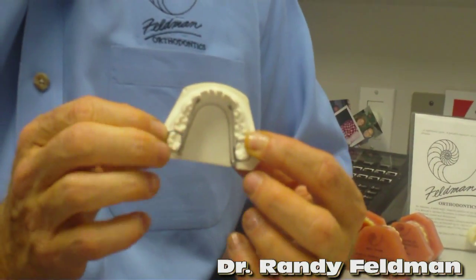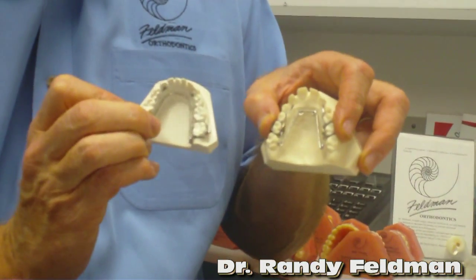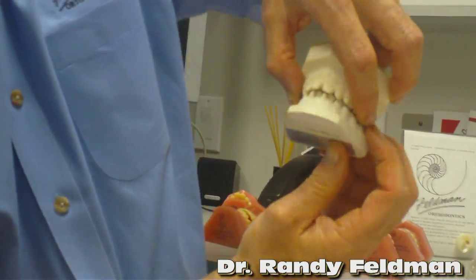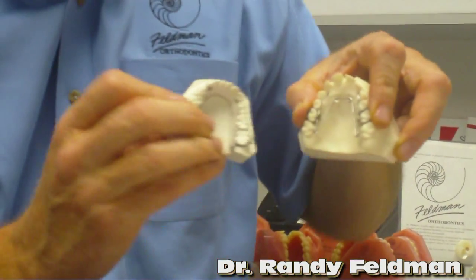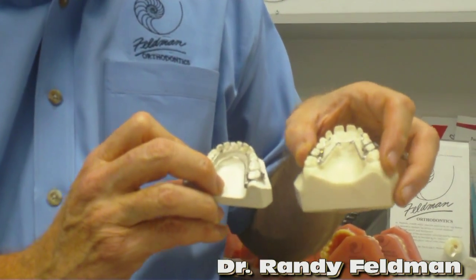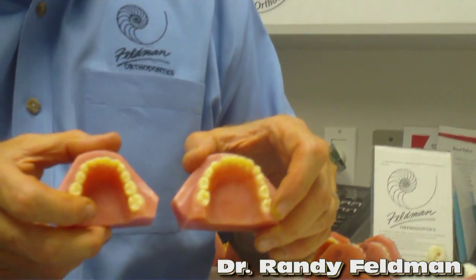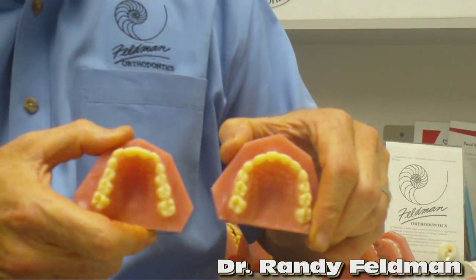It's underneath the tongue and it doesn't hurt the child at all. For the first about five to six months, the children wear something like this — you won't even see it from the outside. From the outside they look absolutely wonderful. As these early and growing children are growing, we have the ability to expand or widen the upper and lower jaw. Here's the lower jaw before and after, and here's the upper jaw before and after.